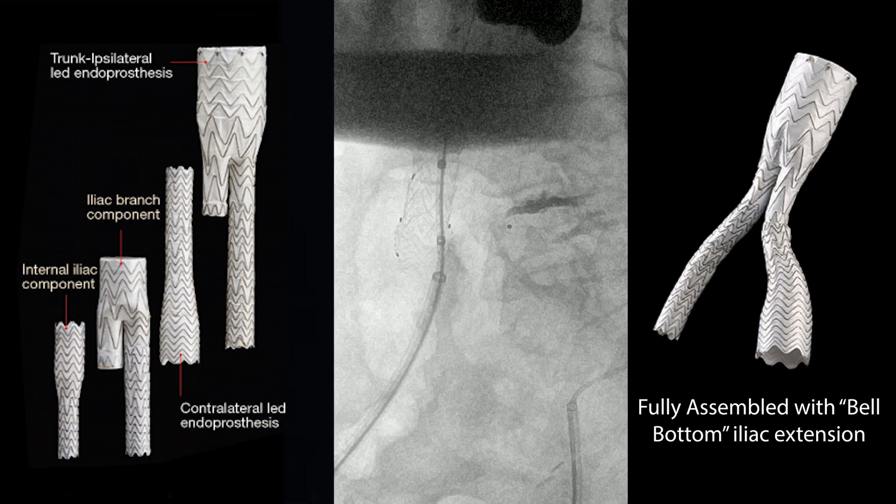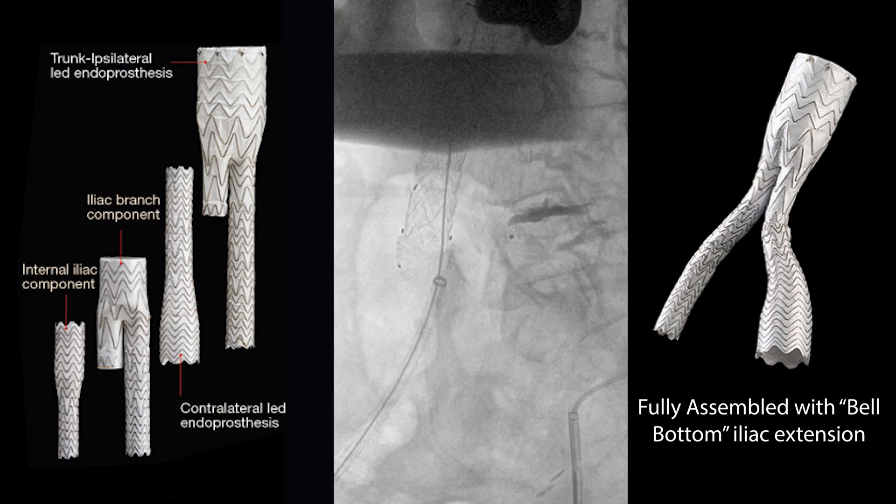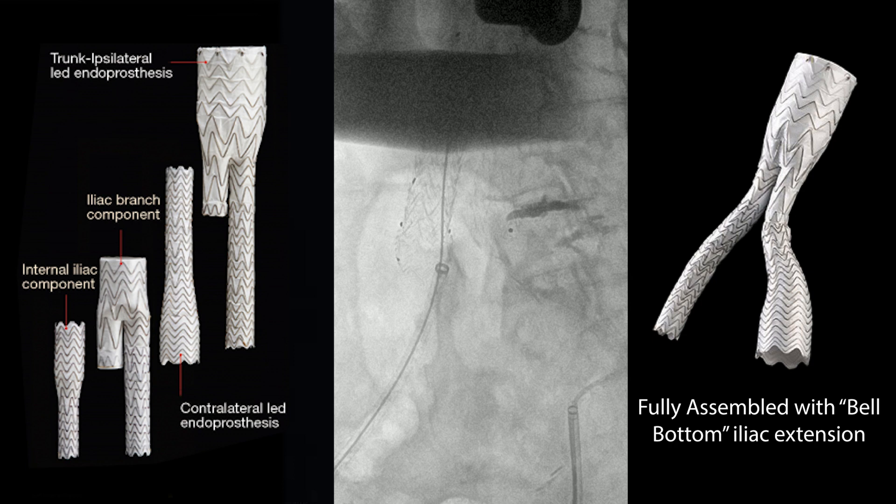Let's see if we can get that to seal up. If you can't get it to seal, then you're either going to have to embolize it or convert this into an iliac branch graft. But that actually seemed to do the trick.